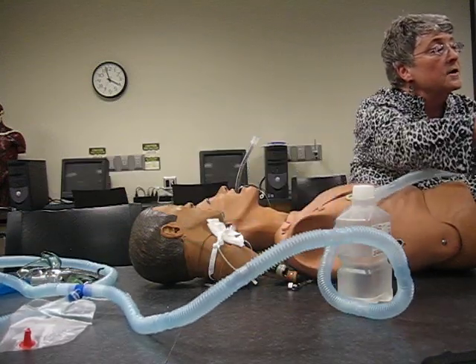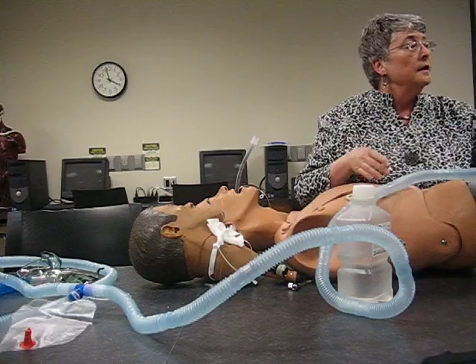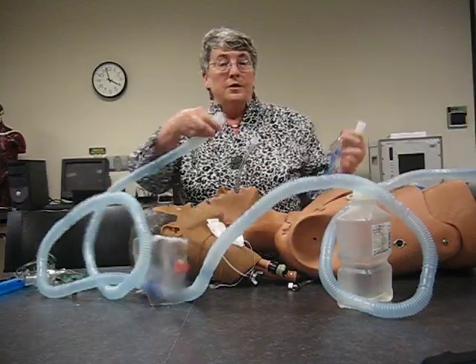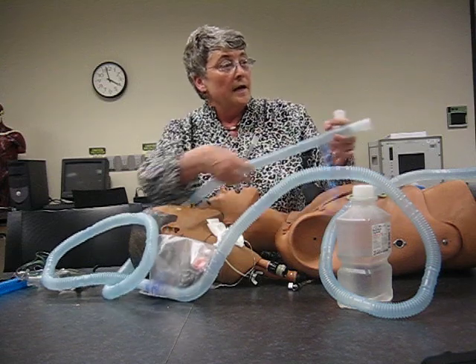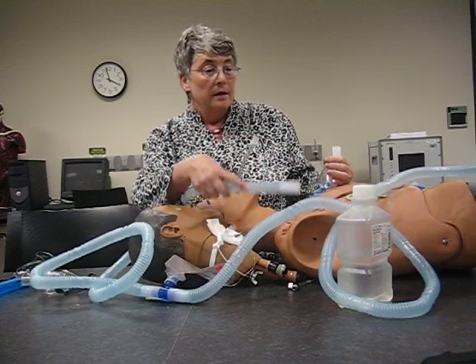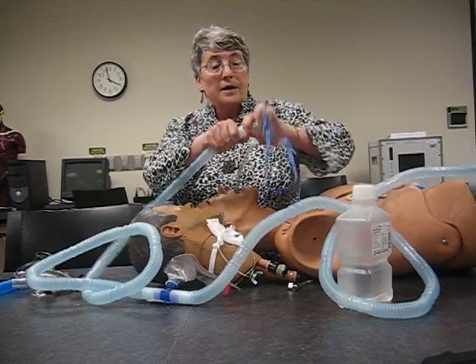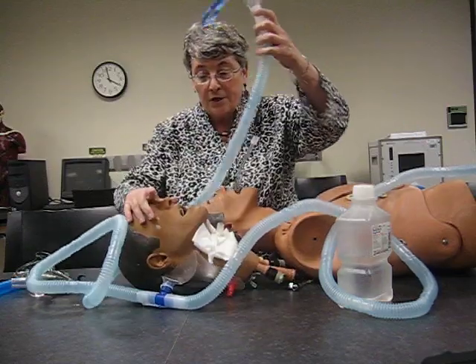This is running at 40%. I'm going to start the liter flow at 10. When I set this up, I should see a mist — and hopefully you can see that. You want to see this mist going through. Then I attach the trach collar and put it on my patient.